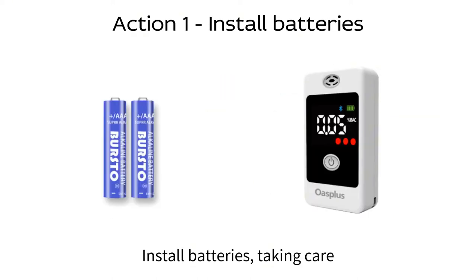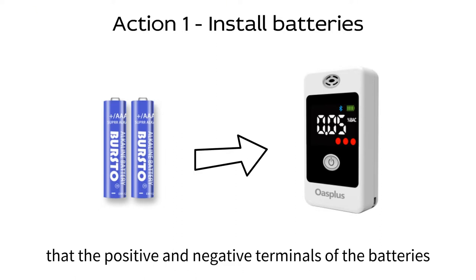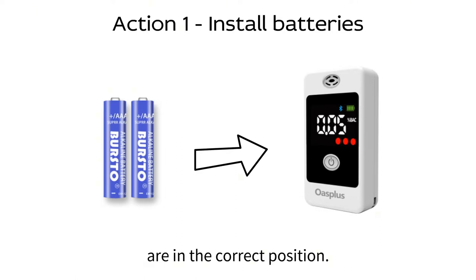Quick guide. Number one, install batteries, taking care that the positive and negative terminals of the batteries are in the correct position.